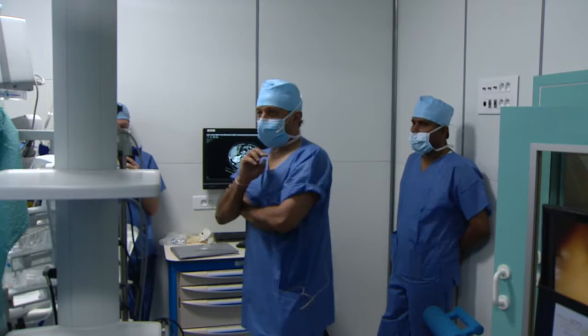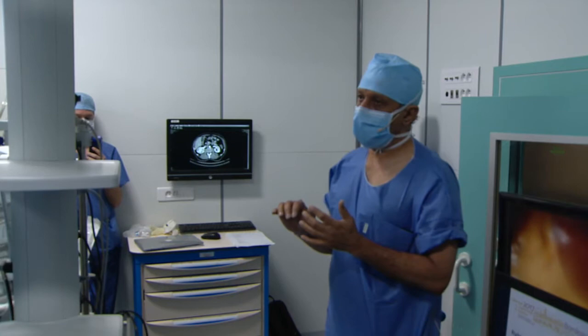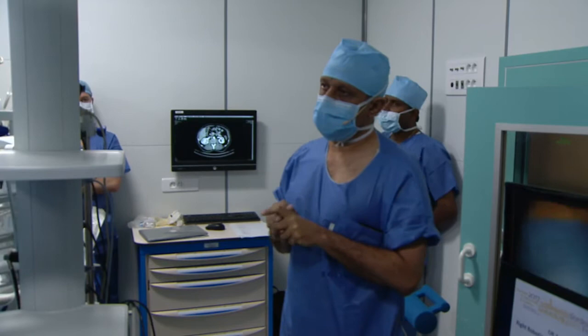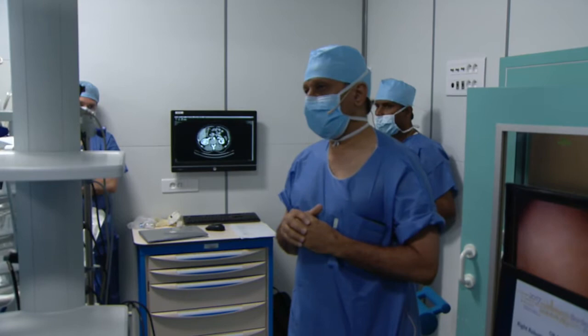So we are going to reflect the colon and the small bowel medially, retract the ureter and the gonadal vein laterally, follow the psoas to the main renal hilum. At that point, get vessel loops around the main renal artery and main renal vein, and then circumferentially mobilize the kidney. Free the ureter off the kidney, circumferentially mobilize it, and we'd have to rotate it 180 degrees such that the posterior surface becomes anterior, upper pole becomes lower pole. Then perform intraoperative ultrasound, score the tumor, and then take it from there.